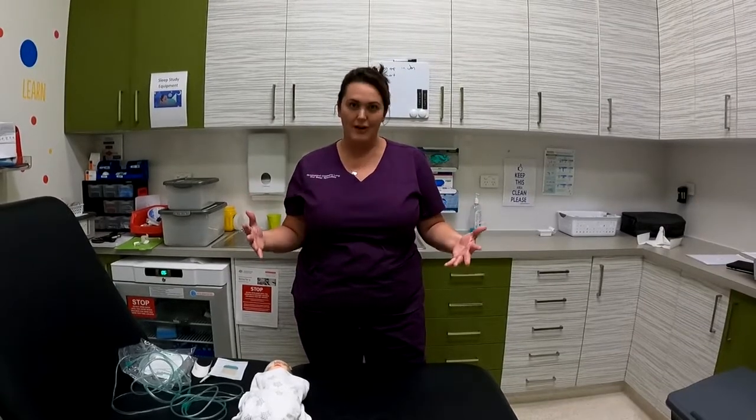So let's get started. By now, your doctor or one of our respiratory doctors should have had a discussion with you around why your baby is going home with oxygen. If you still have any questions about this, please let me know. Basically, the aim of the oxygen is to help your baby grow and thrive.